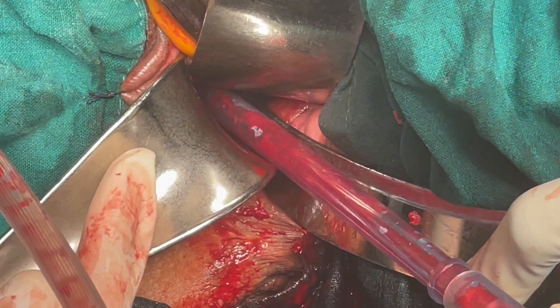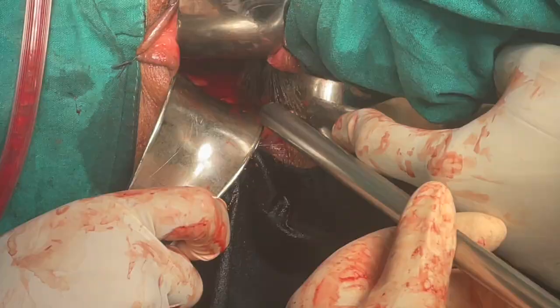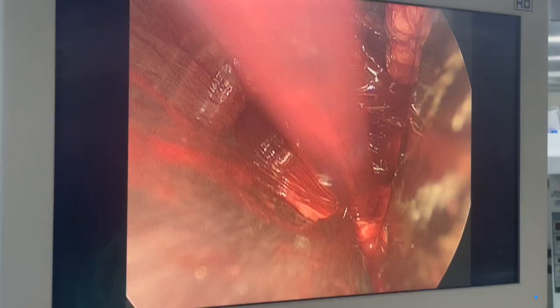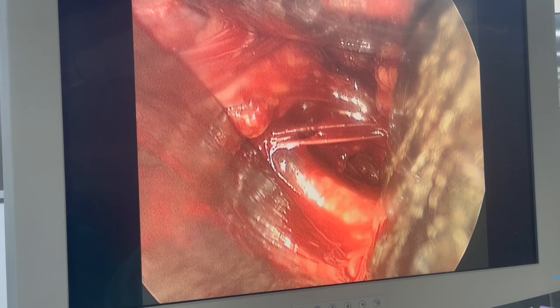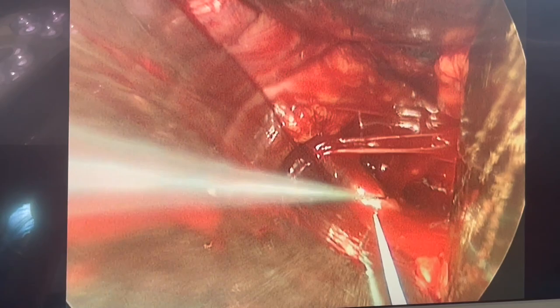The medial one retracts it medially, and the lateral retractor, which is a straight retractor, retracts the vaginal wall as well as the coccygeous muscle. With the help of a 10mm laparoscope we visualize the sacrospinous ligament on the monitor. This is the monitor view as you can see — the sacrospinous ligament is seen as a white band going from medial to lateral end.